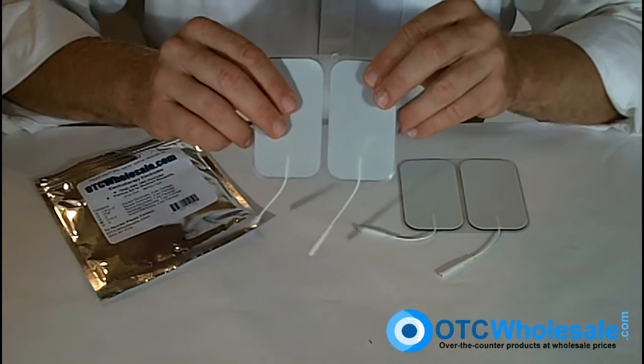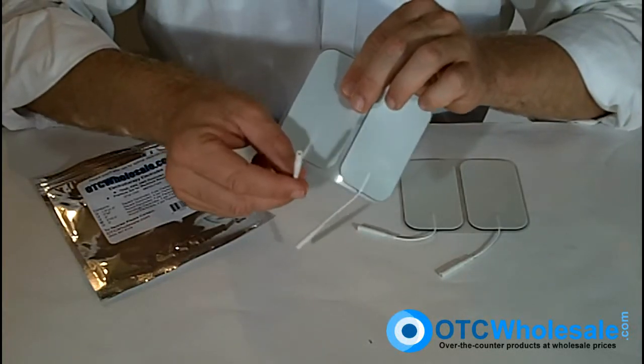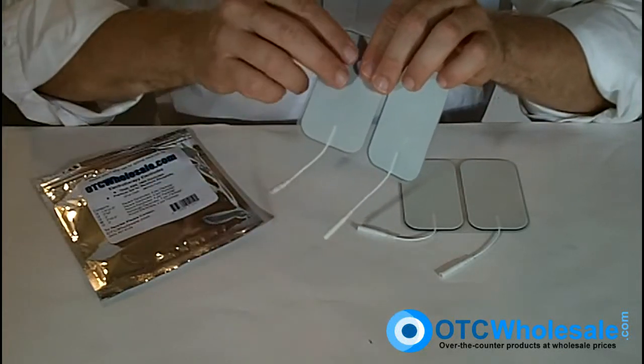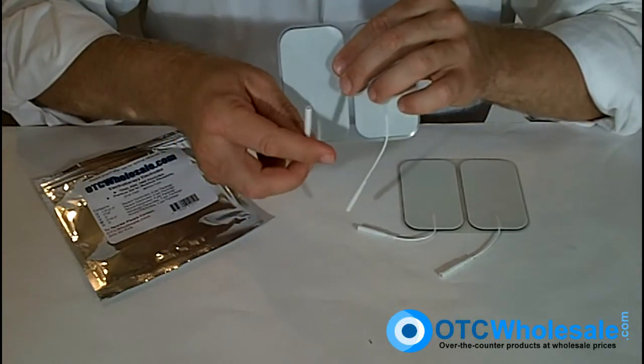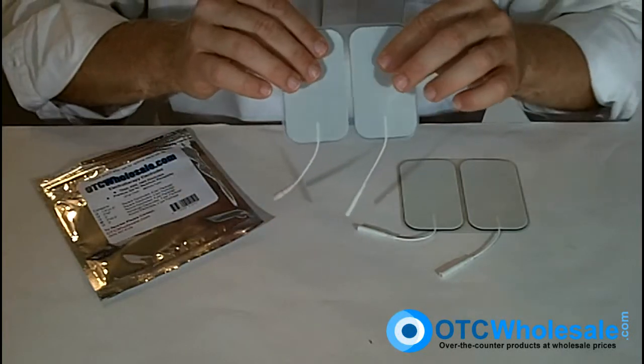A proper care video will come on just after this. The electrode itself uses a pigtail connection, which is almost industry standard. We recommend that if you're looking for an electrode stimulation unit, you choose one with a pigtail or pin connection — an eighth inch pin connector. It'll give you the most choices in electrodes down the line.